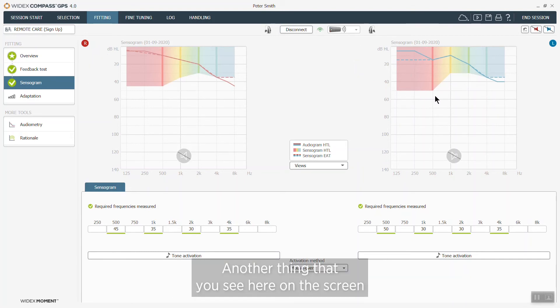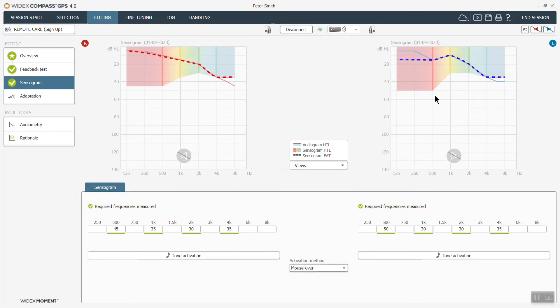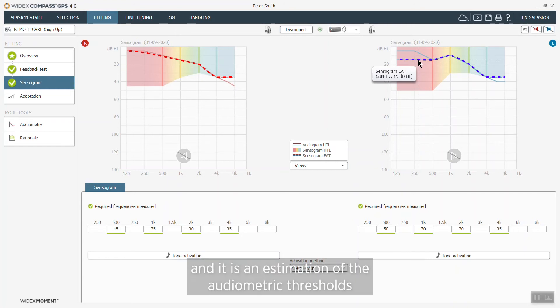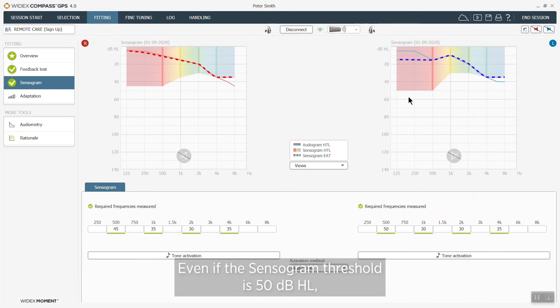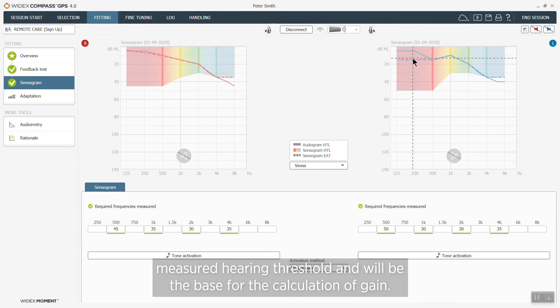Another thing you see here on the screen is a change in the display for GPS 4.0. We are now showing the EAT values, and EAT stands for Equivalent Adult Threshold. It is an estimation of the audiometric thresholds taking into account the Sensogram thresholds plus the ear canal acoustics measured during the test. So even if the Sensogram threshold is 50 here, you can see that the EAT value will be closer to the audiometric measured hearing threshold and will be the base for the calculation of gain.